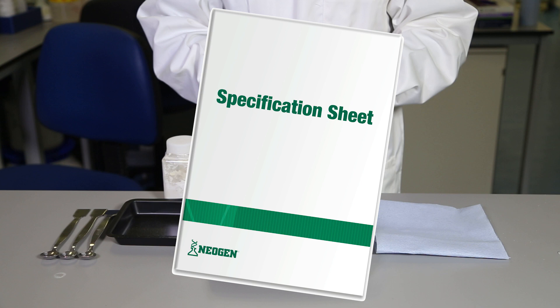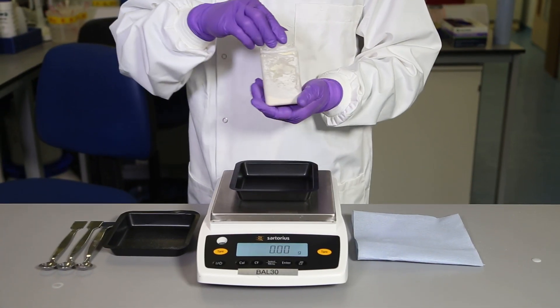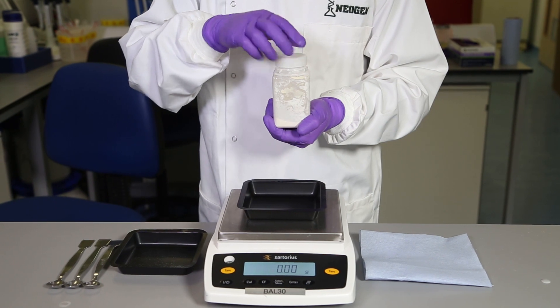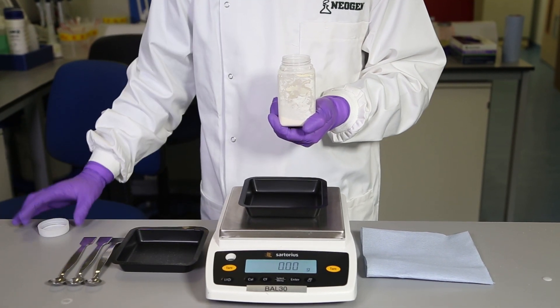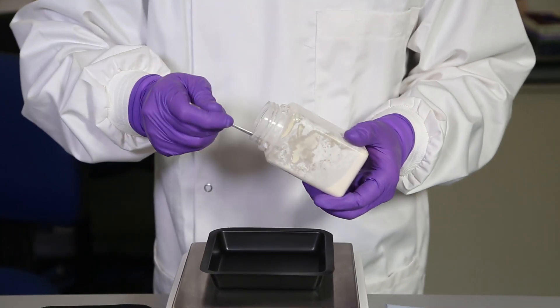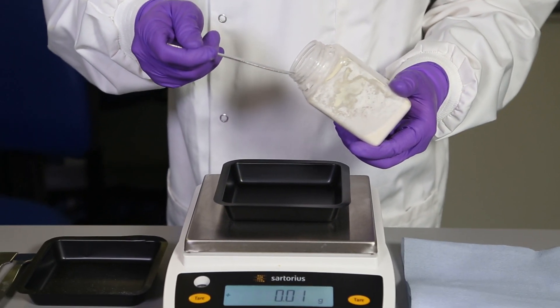When weighing out dehydrated culture media, it is important to ensure the vessels and containers used for weighing and other utensils are clean and dry. Weighing equipment and instruments should also be calibrated and within their service time.